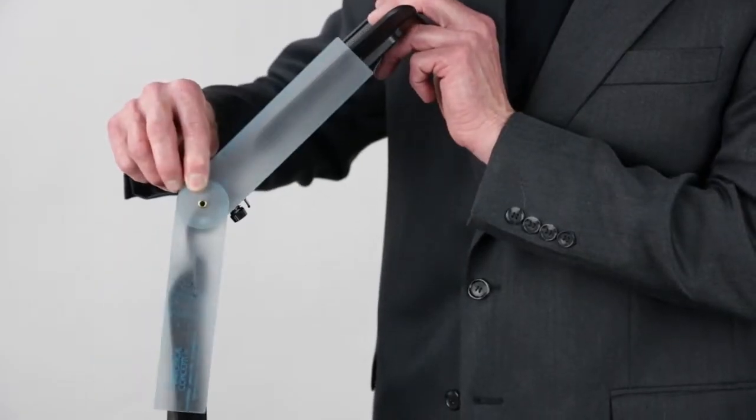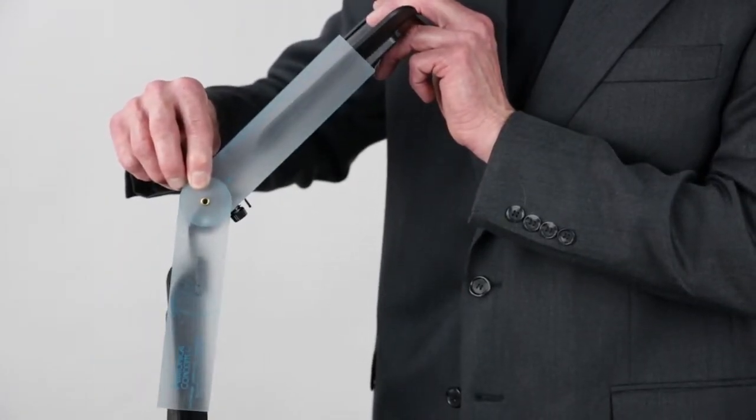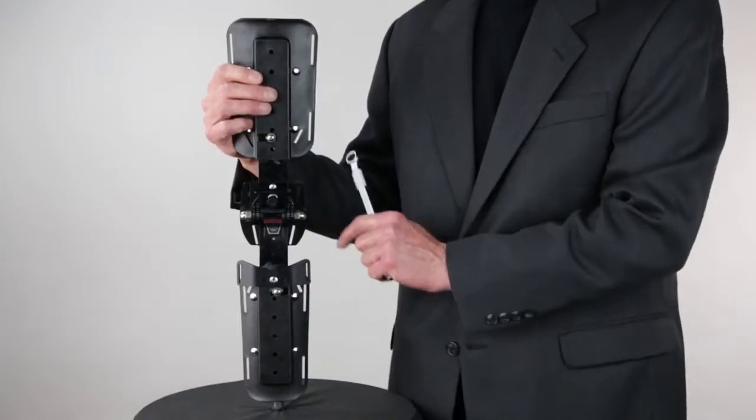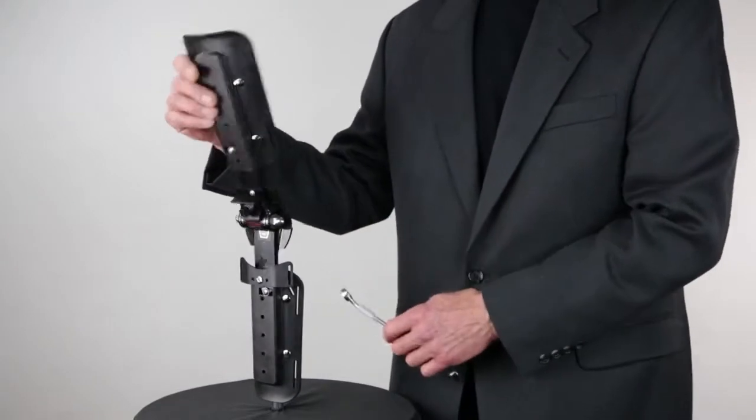If in doubt, a standard goniometer should be used to verify knee range of motion position, or the slide lever can be removed if further range of motion functions are not required.